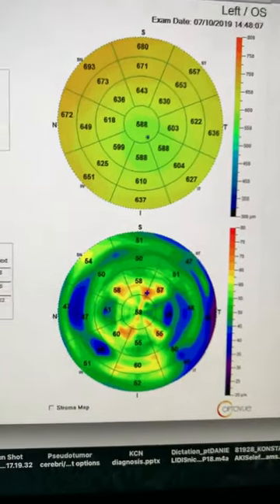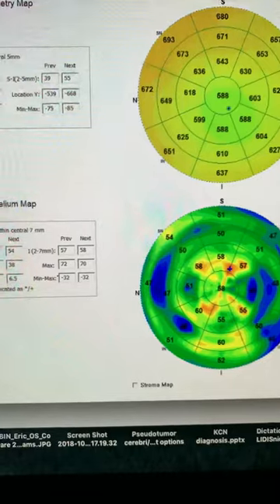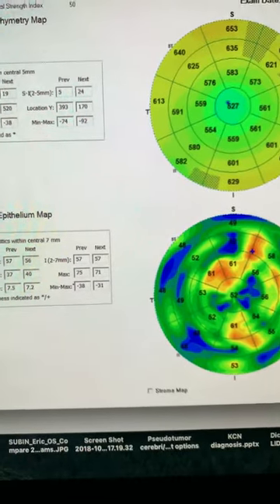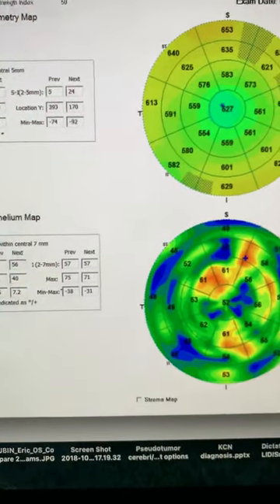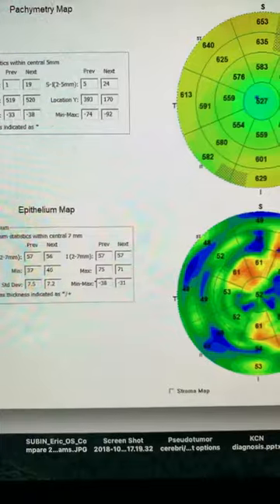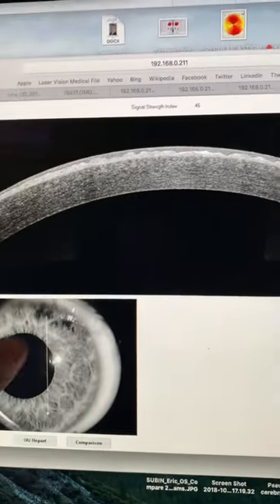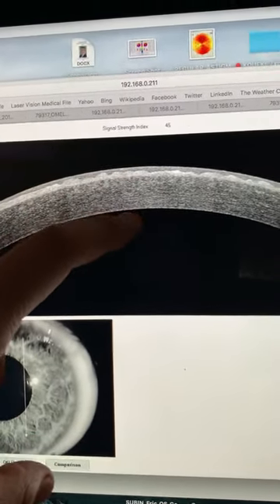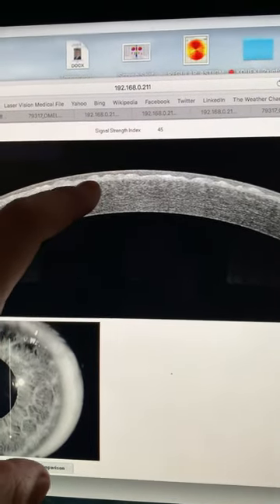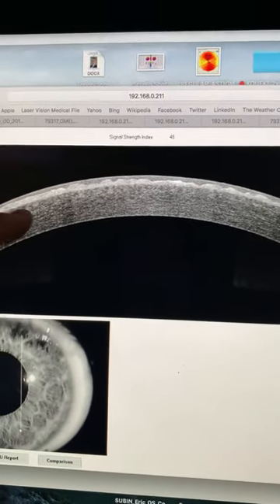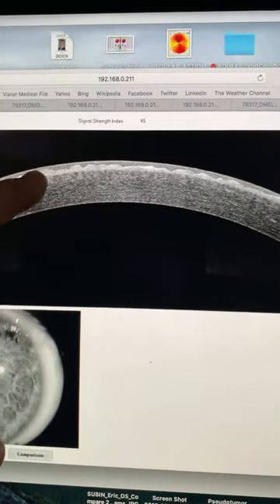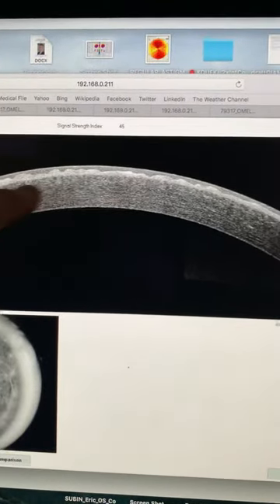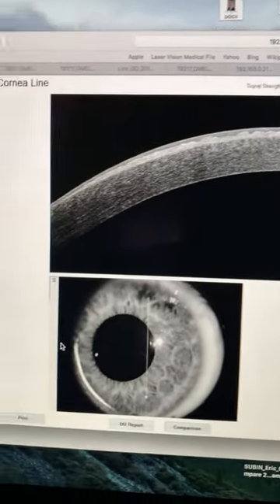We'll go back to the OCT images of the left eye, which is the untreated eye. This shows the OCT findings of Reis-Bücklers' dystrophy, clearly demonstrated in the OCT imaging. We can see that it involves Bowman's membrane. The underlying stroma is naive, and these opacities seem to extend within the epithelium, making the epithelial layer very irregular.